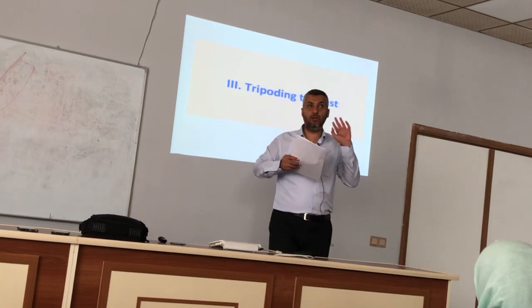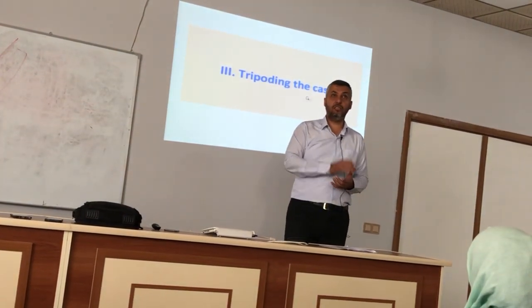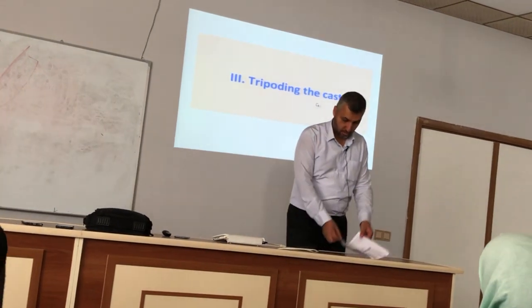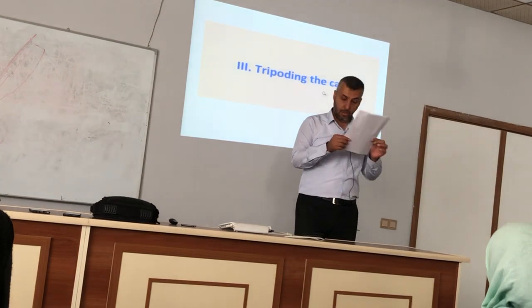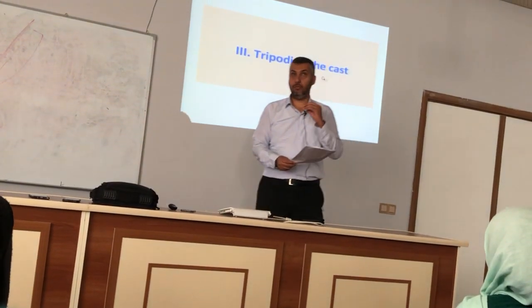I don't know anything about tripoding. I put my cast in this manner, tight, with the screw. After that, I want to remove the cast, remove it, check it for anything. Once I put it back, I may change the position.